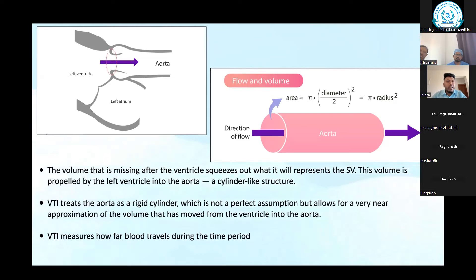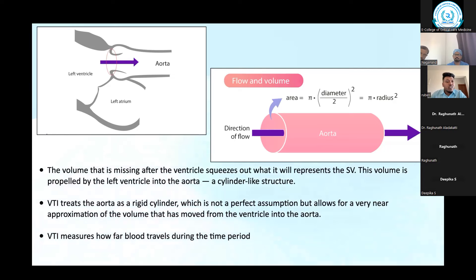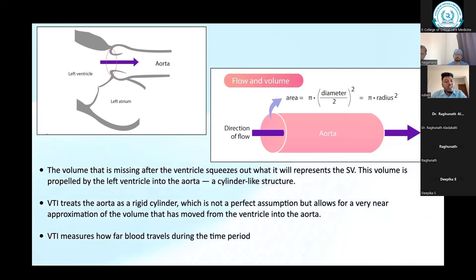You can also think of VTI as measuring how far blood travels during that time period. If you consider the aorta as a cylinder, the area is calculated by pi r squared or pi (d/2) squared. Once you get the cross-sectional area from the parasternal long-axis, you then look at the flow velocity using pulse wave Doppler. You keep the Doppler gate at the aortic valve opening in the apical five-chamber view, and you get a spectral waveform — a dome-shaped wave. The machine calculates the area under that curve automatically when you trace it.